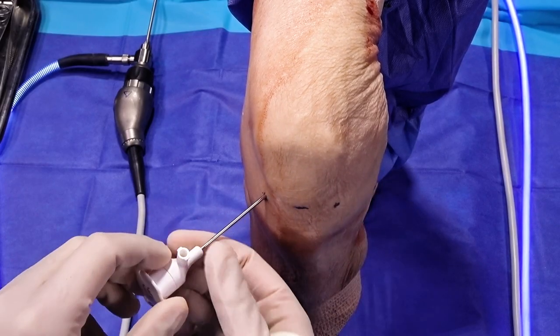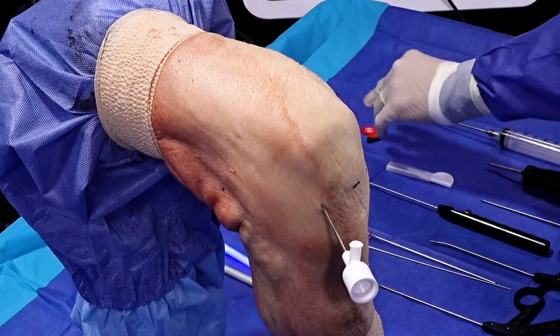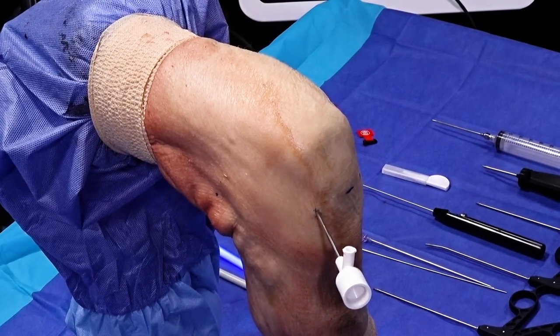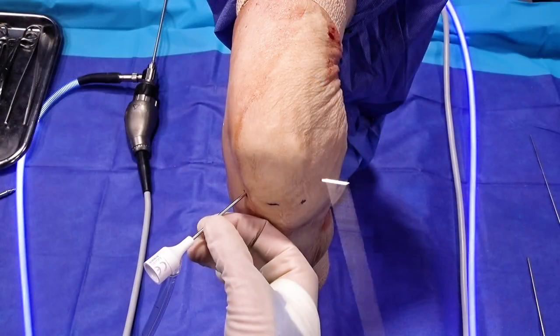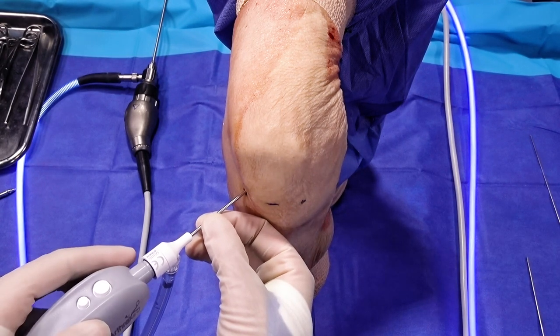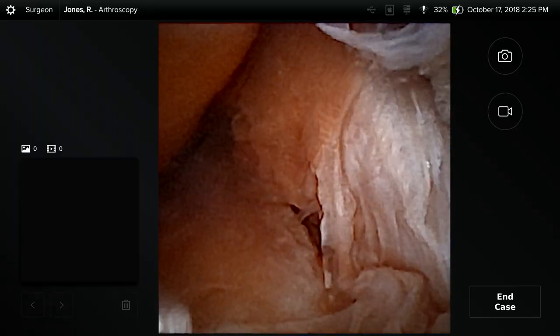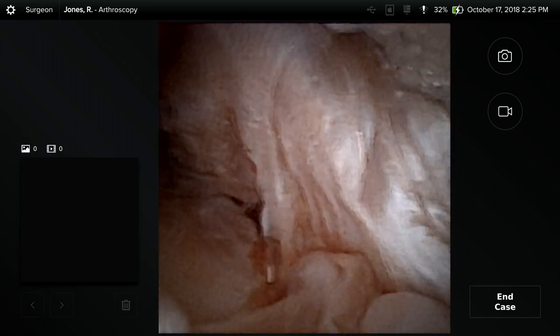So here we have a right knee. We're going to go ahead and demonstrate our ability to use the nanoscope here. We can hook the inflow from the pump in the OR environment right to the cannula. Now we'll introduce the nanoscope into our cannula. You can see right away we're oriented — we're in the notch. That's your ACL ligament that we're looking at right here.